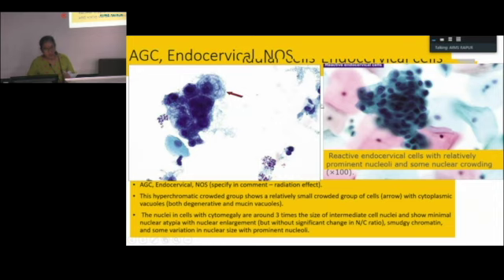Where you know the reason for the atypia, for example, in this patient radiation, you can put it in the comments that there was a history of radiation given to this patient. Most probably this atypia is related to radiation. So you have to qualify the atypia. You have to give a reason wherever possible.